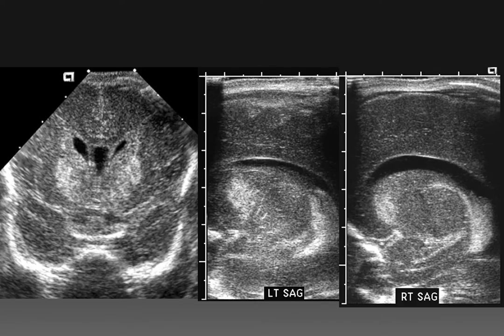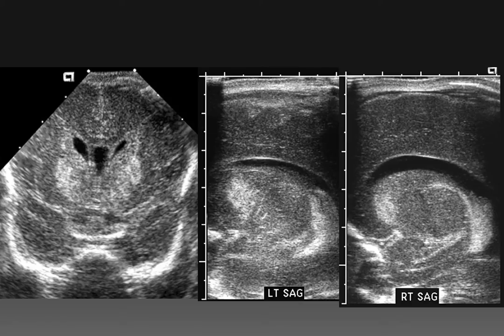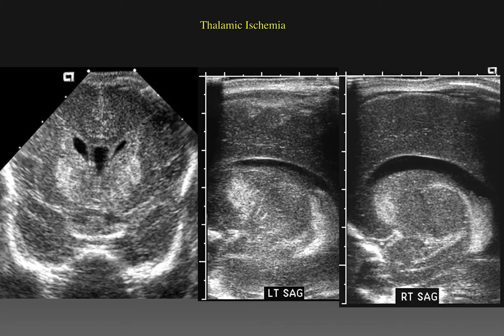Here we have a child who is approximately 30 weeks, who has symmetric bilateral basal ganglia echogenic lesions that are moderately bright. But unlike hemorrhage, they do not exhibit a mass effect and do not displace normal structures. In this situation, we need to include focal neuronal ischemia. At pathology, this child had focal neuronal injury in the basal ganglia.